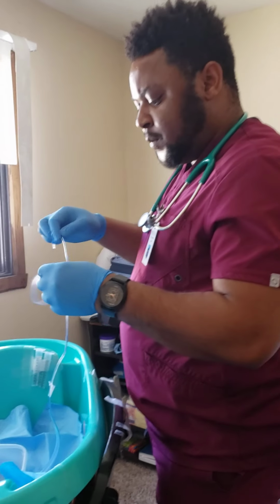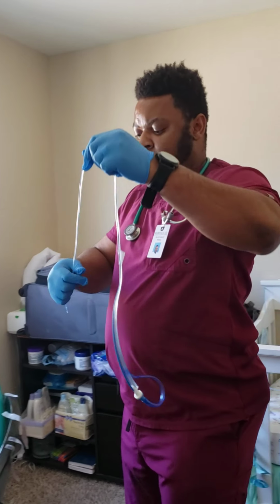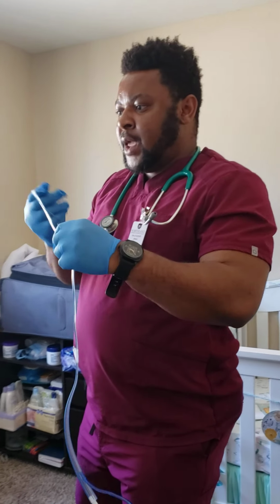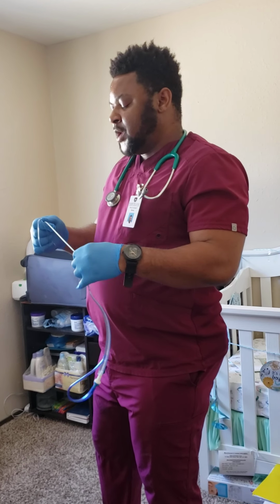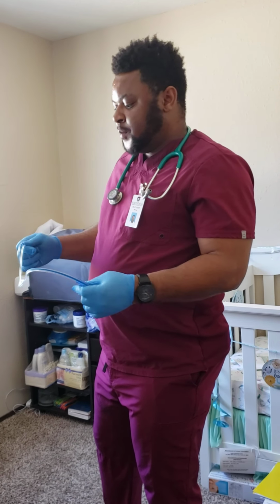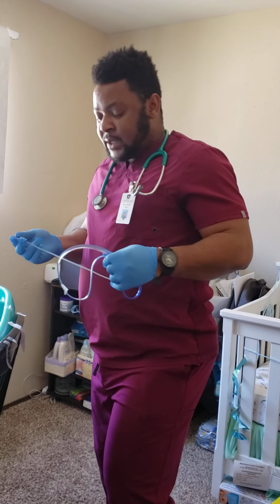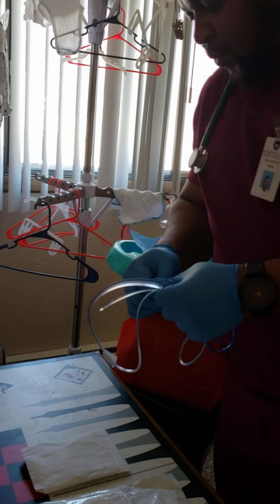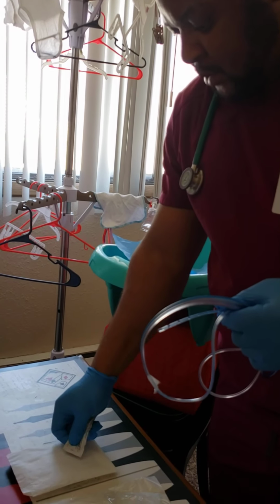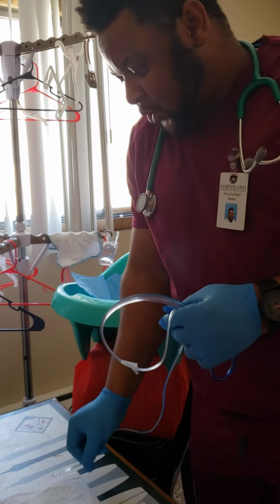Then I'll put a little tape to just mark the area. I also want to coil the tube and put it in ice water to permit it to easily penetrate down into the patient's stomach. After doing that, I will take my lubricant, open it, and lubricate the tip of my tube.